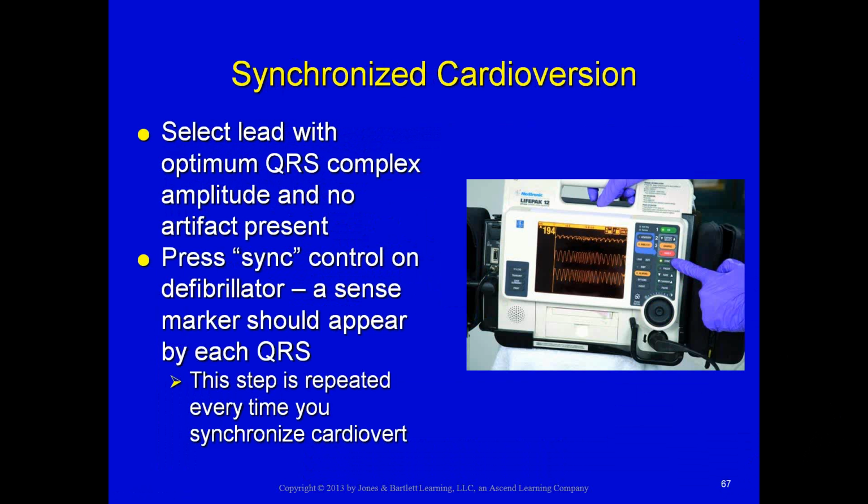Select the sync mode on the monitor, and this is a step that you have to do each and every time you synchronize cardiovert, because when you press the sync mode, there's going to be a marker that shows up on top of the QRS, and this is the monitor identifying where on this complex it's going to deliver the shock, because when we defibrillate, the shock is just delivered immediately when we push the button.